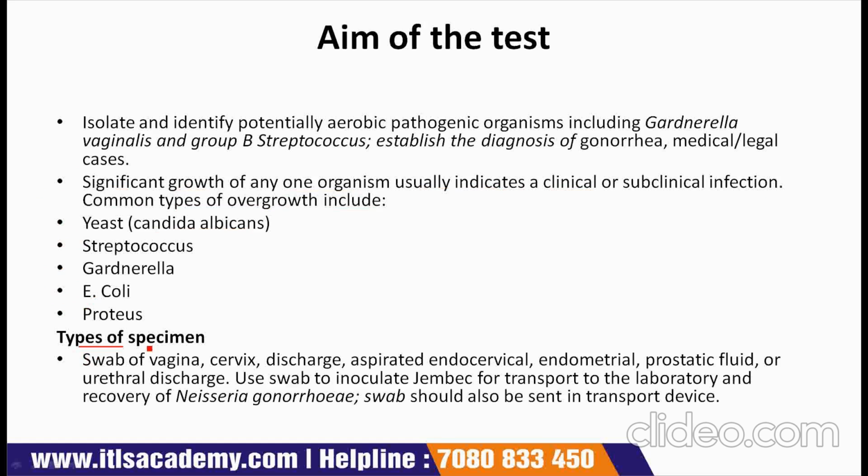Types of specimen. Types of specimen include swab of vagina, cervix, discharge, aspirated endocervical, endometrial, prostatic fluid or urethral discharge.